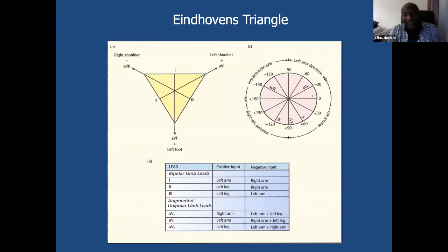Which is relevant for pacing, for CRT. This is really, really important, that you can work out the axis of the heart if you're LV pacing only or biventricular pacing, and what the 12-lead ECG is going to look like. You're looking at your V1 and your lead one. Is it a right bundle morphology, is it narrow complex, is it more right axis and things like that. This is really, really relevant.